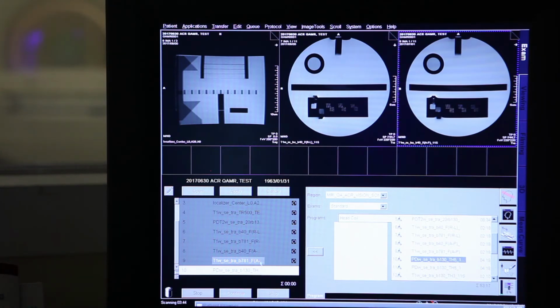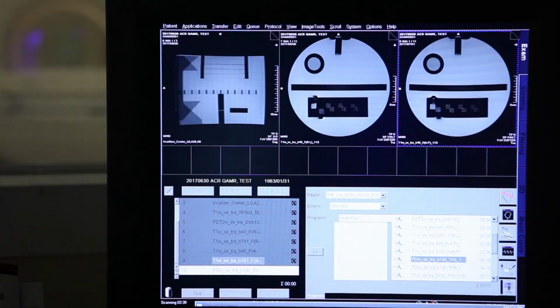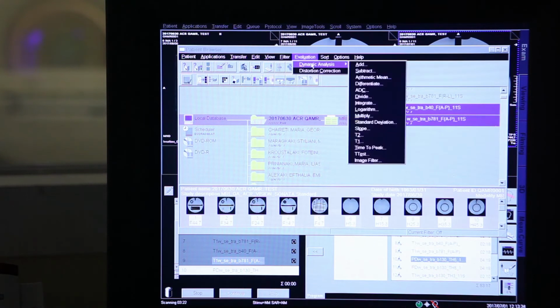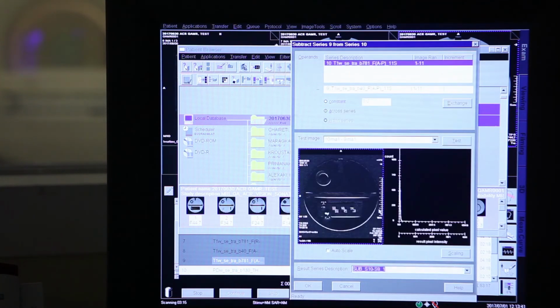Now let's do subtraction between the two. We go here, sorry, and we're taking the other images. Be aware about this. We were talking frequencies in the right-left axis, and now the frequencies in the AP axis. I'm going to subtract again these two series of images and expect to see something different, a rotation of the artifact. Exactly. That's good. There it goes, exactly from the other side. So the artifact follows the frequency direction, which is this here.